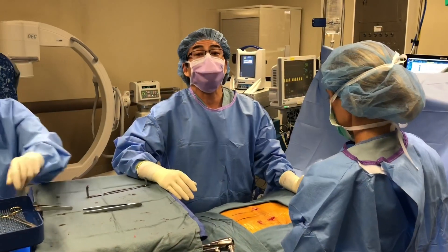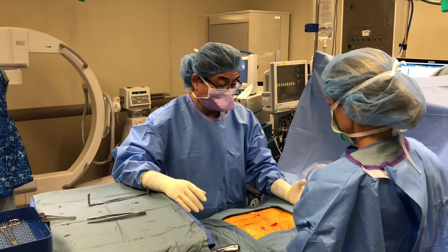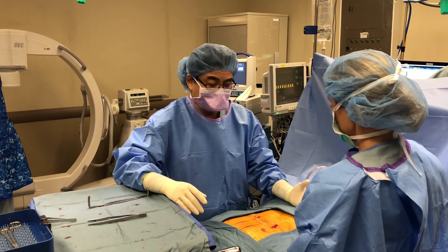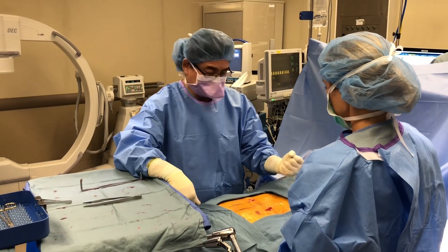The surgery is all done. It went perfectly. We'll show you the before and after X-rays and you'll notice the correction is very, very good. I'm really happy. I'm about to close the wound and we're all hoping that you get better really fast. Best wishes.